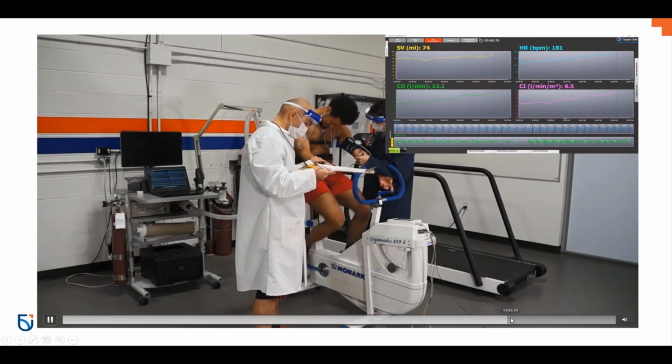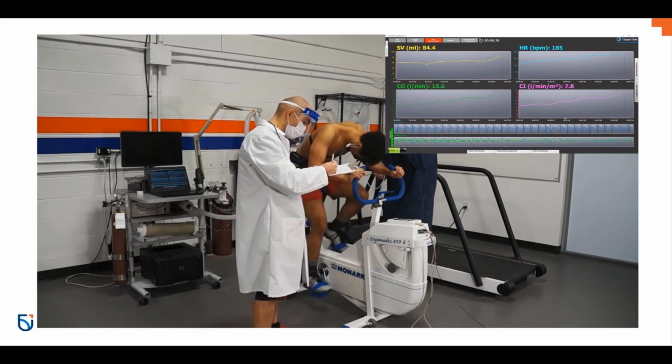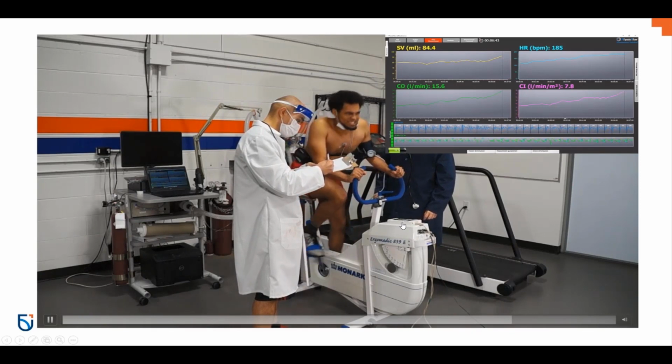Trying to take our measurements. It's hard to take blood pressure like this too, especially when the person's really rocking and they really want to get those RPMs back up to 70. Keep in mind he has to maintain 70 RPMs the whole time.